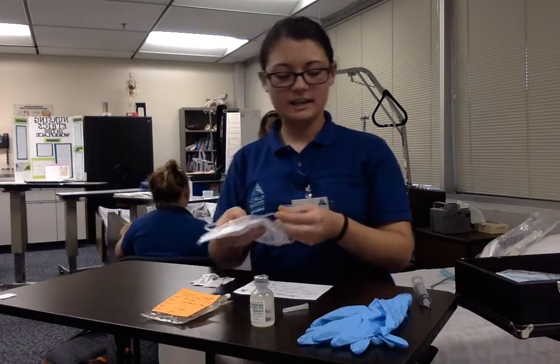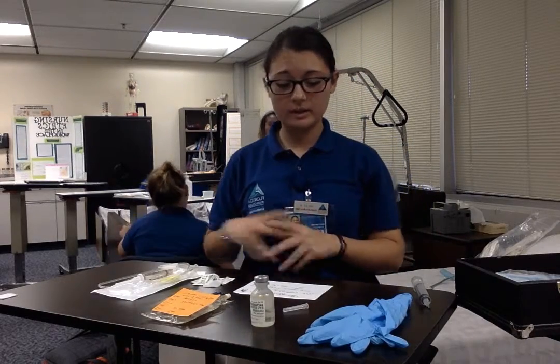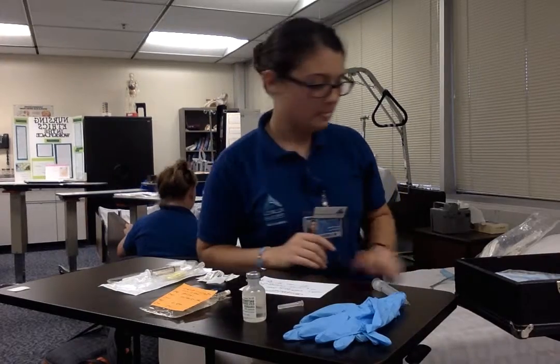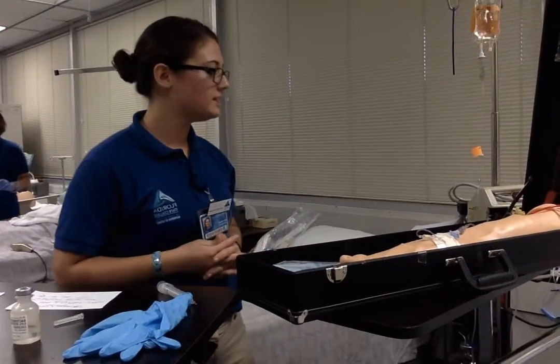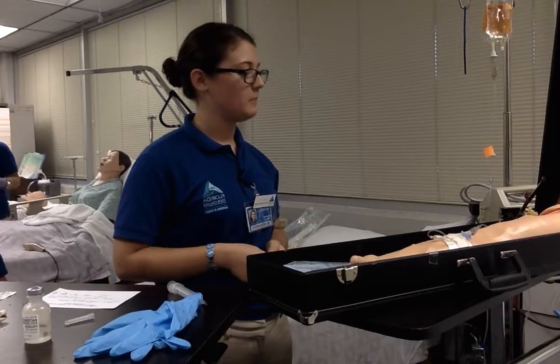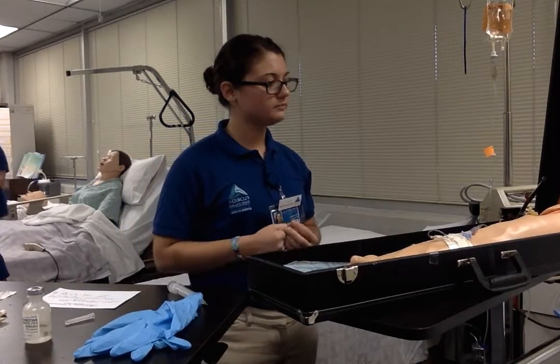So I'm going to go ahead and bring all this stuff into the patient's room. I already made sure that my patient wasn't allergic or anything like that, but I'm going to verify it in here. So, I'm going to walk in my room. Hello, my name is Haley. I'm going to be your student nurse today. Sir, can you please tell me your name and date of birth? Alright. Mr. Jones, do you have any allergies that you know of?